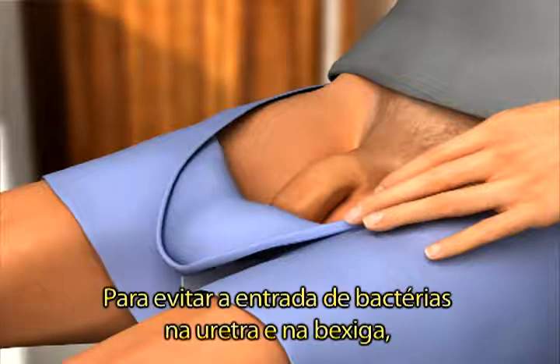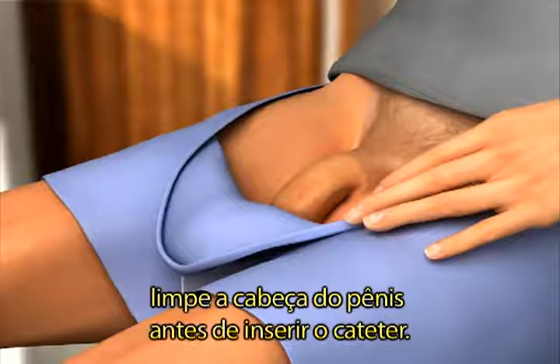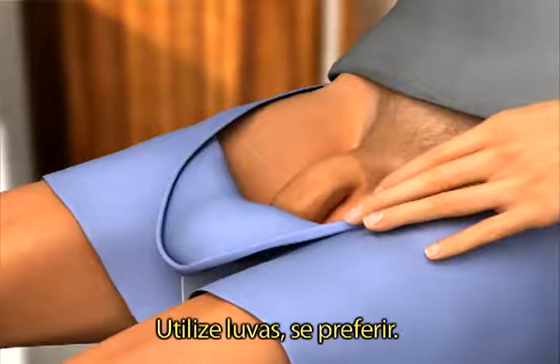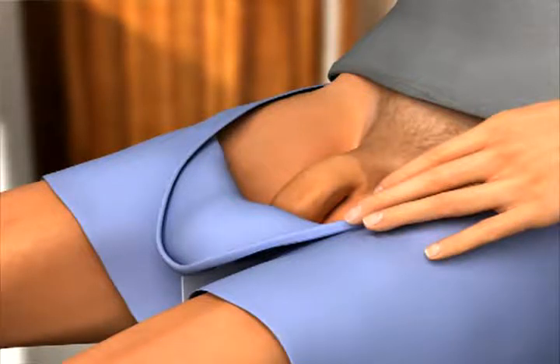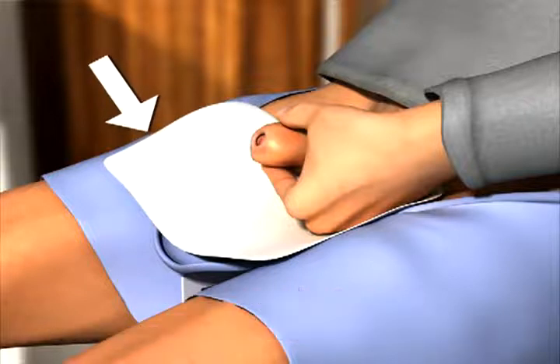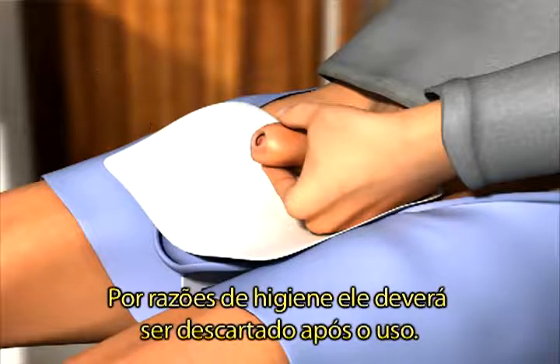To prevent pushing bacteria into the urethra and bladder when you use the catheter, you must first clean the head of your penis properly. You can use gloves if you prefer to. To avoid wetting your clothes, make sure you place a drape under your penis. For hygienic reasons, the drape must be disposed of after use.